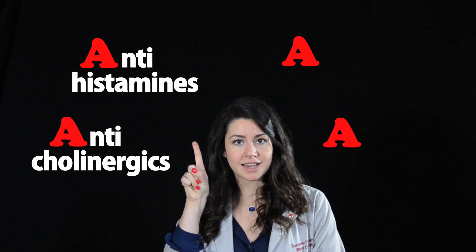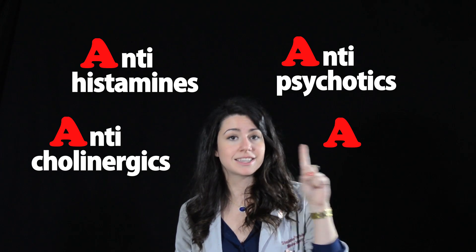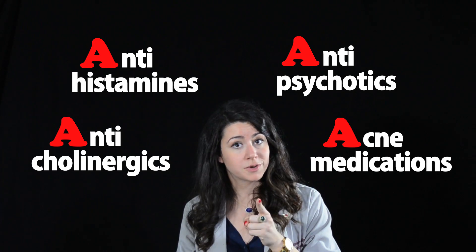Be sure to take note of any medications, both topical and systemic, that may affect the ocular surface, and pay close attention to the four A's: anticholinergics, antihistamines, antipsychotics, and acne medications — all of which can cause dry eye.